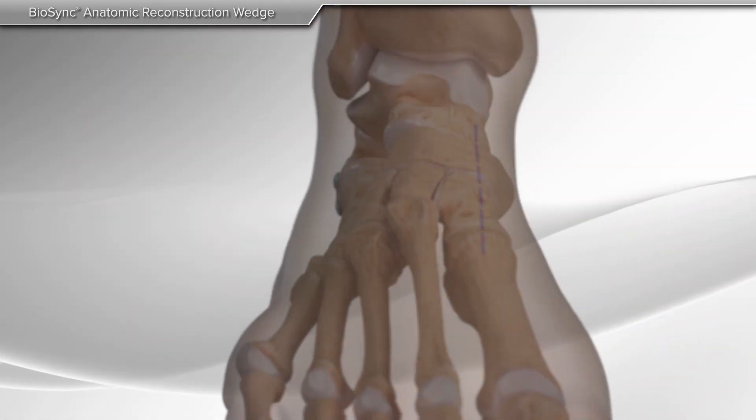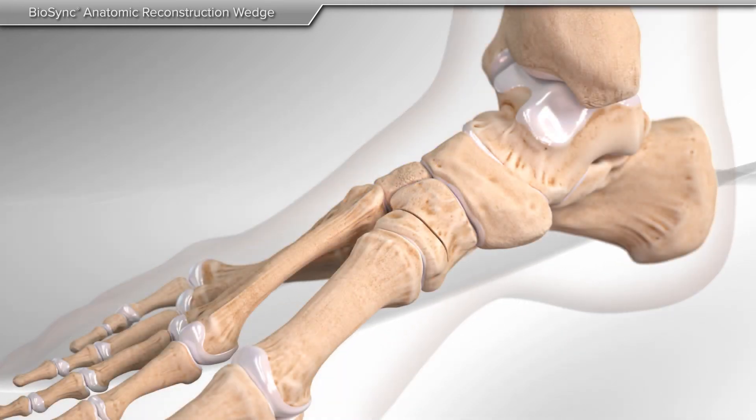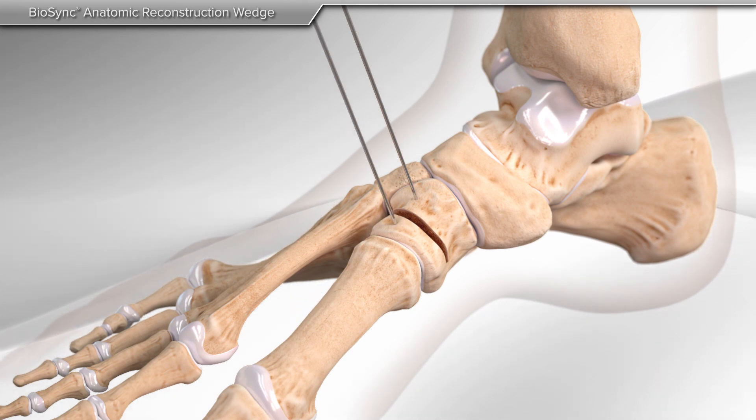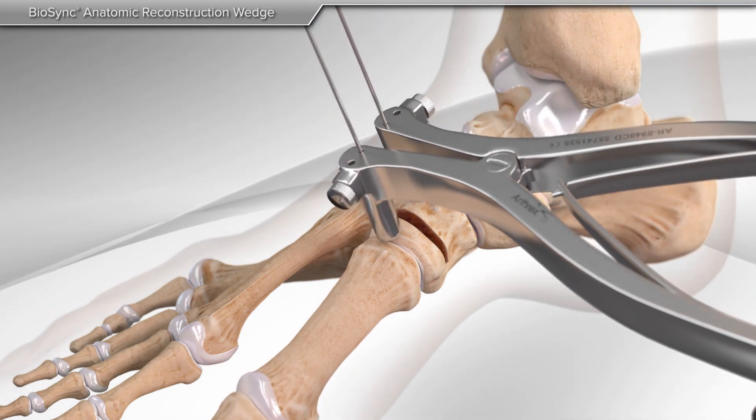In the cotton wedge technique, an incision is made over the top of the foot. Your surgeon cuts the bone to allow for placement of the Biosync wedge. A pin is placed on both sides of the cut bone, and a distractor is placed over the pins to allow for opening the bone in a controlled manner.